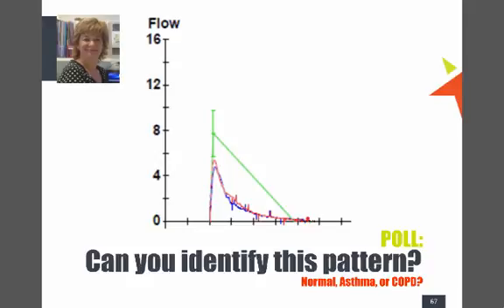Hopefully you feel a little bit more confident having a look at those. It's a bit more tricky with the numbers. We could do another chat on that if you want down the track. Look at the predicted. Somewhere on the spirometry printout there are numbers that are normal for that person. Are the numbers you've got within normal range? If the ratio is normal, there's not obstruction. It can't be COPD if there isn't obstruction.